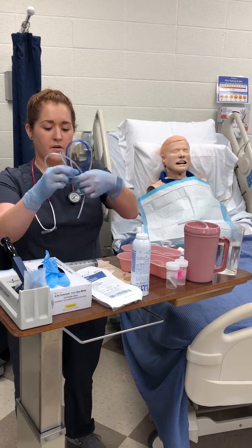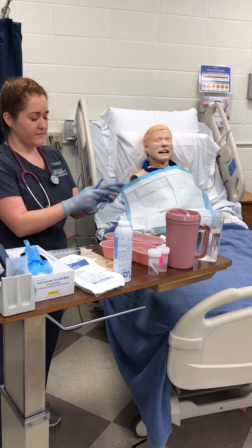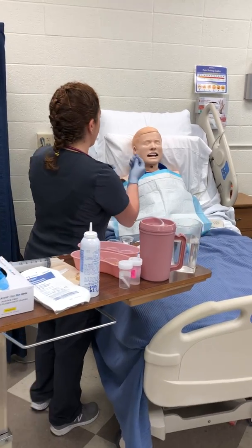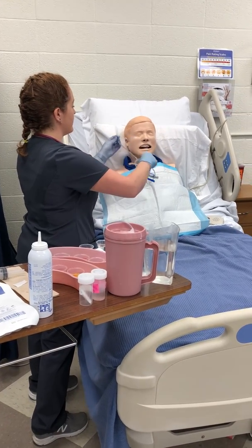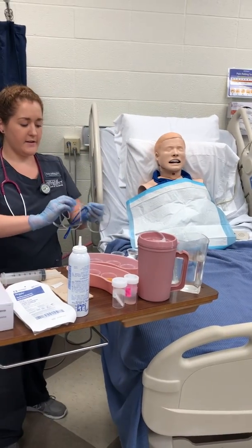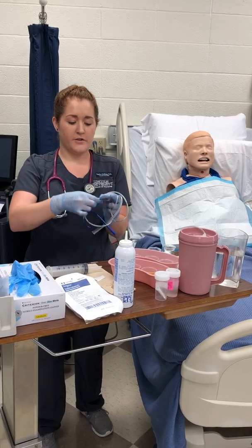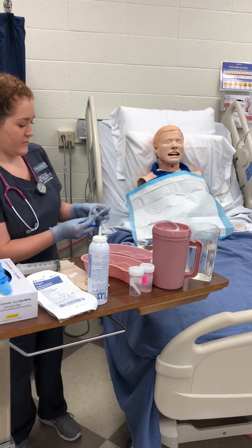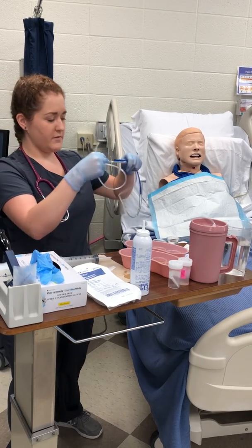I'm going to get the NG tubing out and open, flex it a little bit just so it's not quite so stiff. And I'm going to measure the length of the tubing — from the tip of the patient's nose to their ear, and then from the ear down to the xiphoid process. Now that I've got that, I have prepared my tape in advance so I don't have to struggle with it. I'm going to use tape to mark the tubing so that I remember how far it should be inserted, which is at 48. Next, I am going to lubricate about four inches of this.